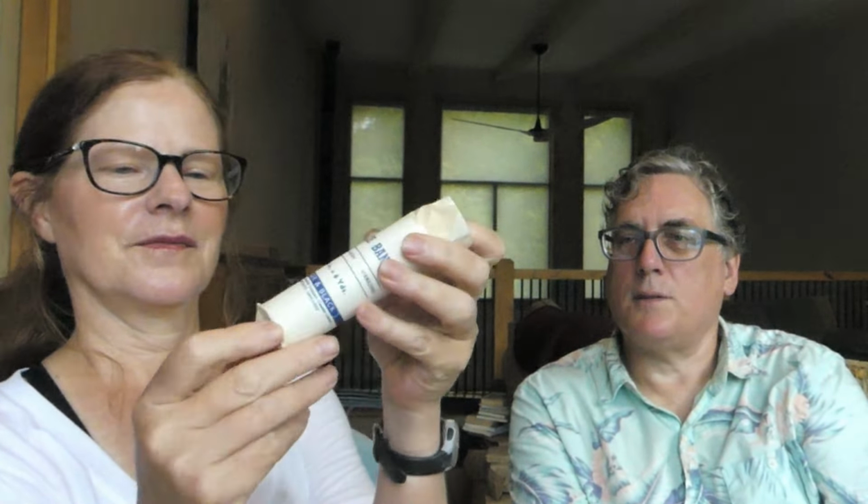And they're so cute, isn't it? They're very cute. It's like something Granny Nurse would have used. Yeah. Open it up. Oh, you want me to open it? Yeah, I do. Lovely. So that's opening. It's supposed to be sterile inside, so you could use it for wound packing, but I can't imagine you would. I certainly wouldn't use 60-year-old equipment.